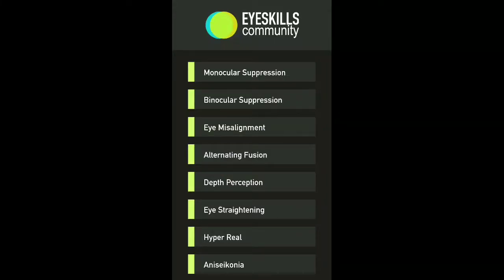Okay, so this is a super quick run through of the Community app. I've connected a Bluetooth keyboard. You can navigate up and down in the menu with W and X. Binocular misalignment measurement. Binocular audio file missing. Well, there's the first bug, audio file missing.